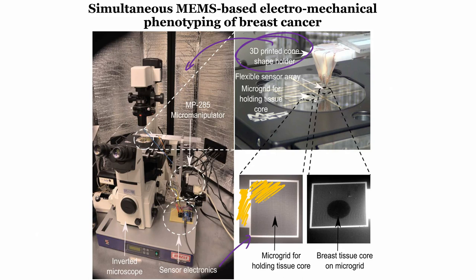Because our idea is to use this pad to apply a voltage to the tissue, right? So if I use this as a gold pad instead of making a mesh, can I use it or not? What's the purpose of making a mesh? Why can't we use a gold pad like I'm showing you right over here? What are the limiting factors? Why have we not selected a thick pad, and why are we going for a microgrid array? That is our query, that is our question.